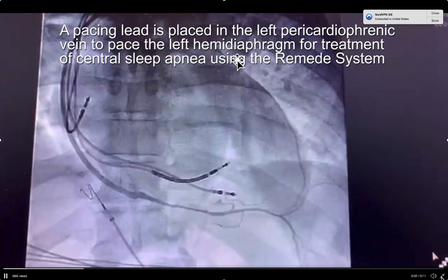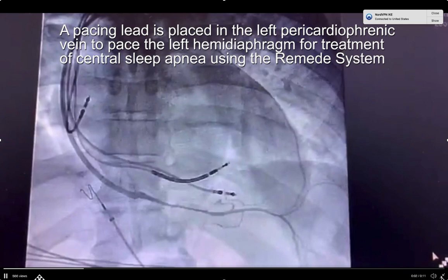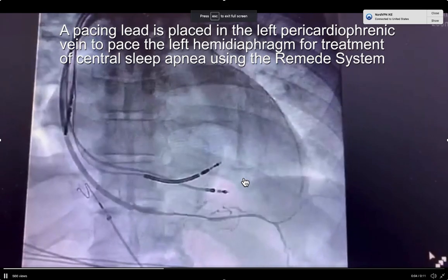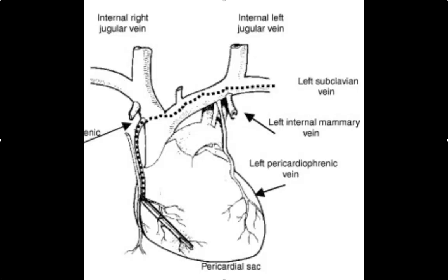A pacing lead is placed in the pericardiophrenic vein to pace the left hemidiaphragm for treatment of central sleep apnea using the remede system, which is recently approved by the FDA.